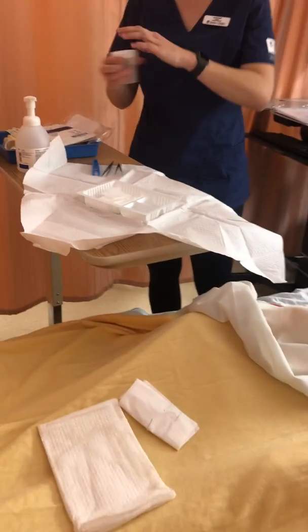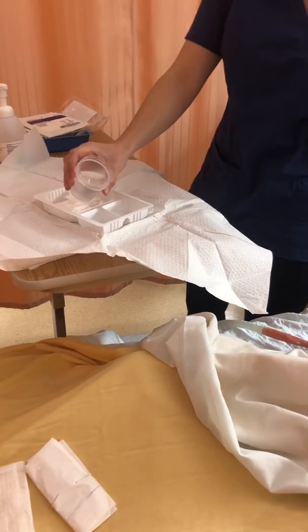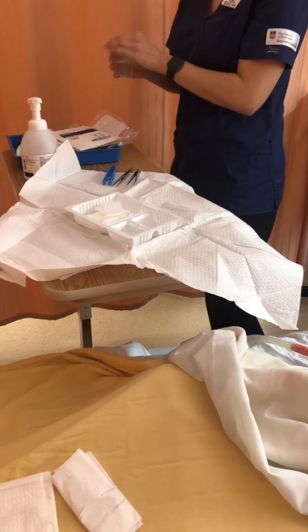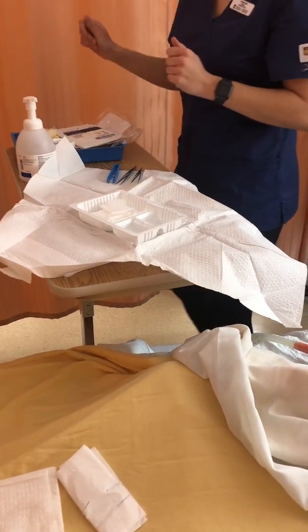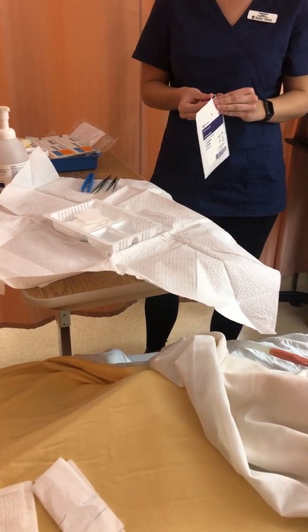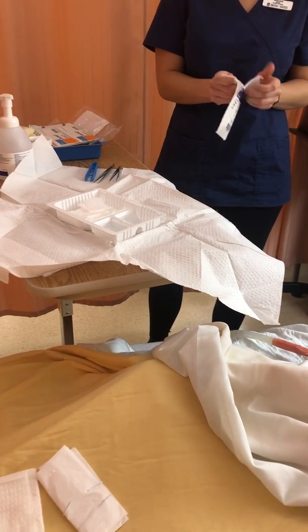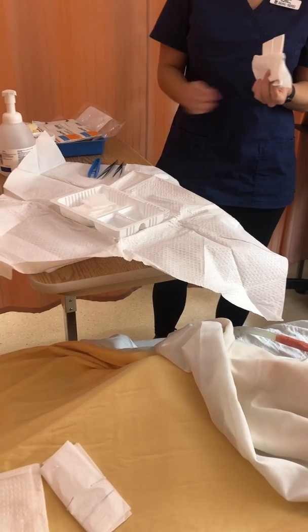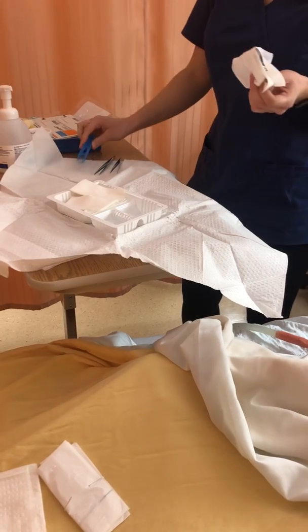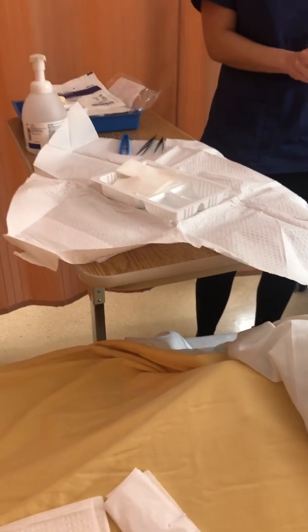I'm going to add some normal saline to the tray. Be careful not to splash on anything. And I will add my drain sponges here. So I know that I'm going to need 2 drain sponges here. And then I have a 4x4 in there to cover the dressing after. I'm going to add my Gelonet.